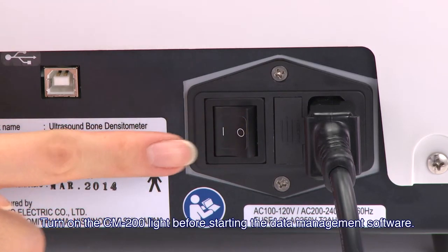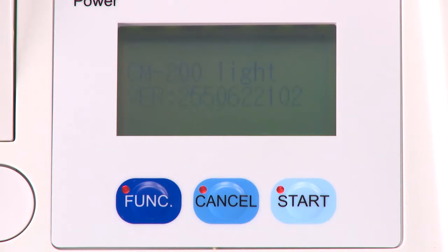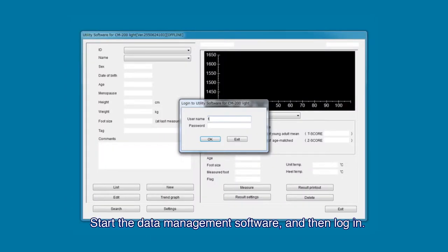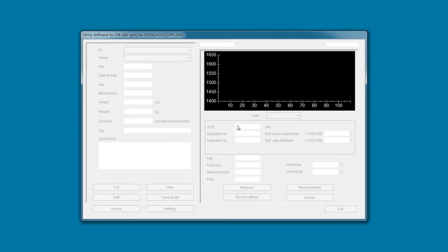Turn on the CM200 Lite before starting the data management software. Start the data management software and then log in. The prompt for initialization is displayed on the screen.